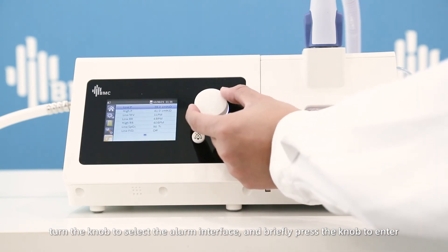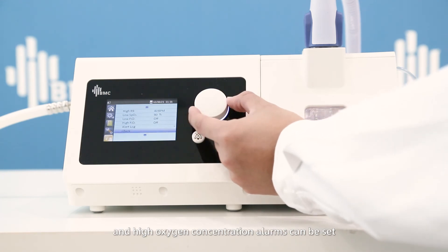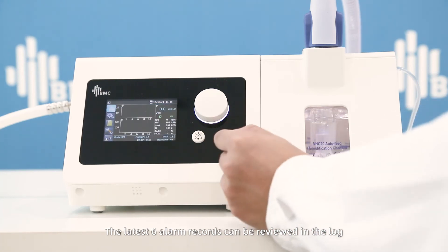Briefly press the knob to enter. Low oxygen saturation, low oxygen concentration, and high oxygen concentration alarms can be set. The latest six alarm records can be reviewed in the log.